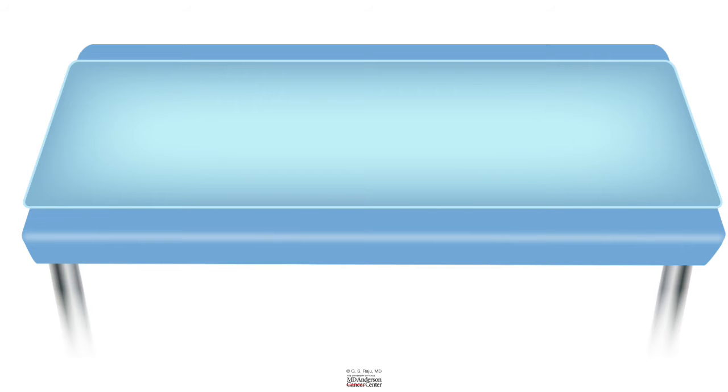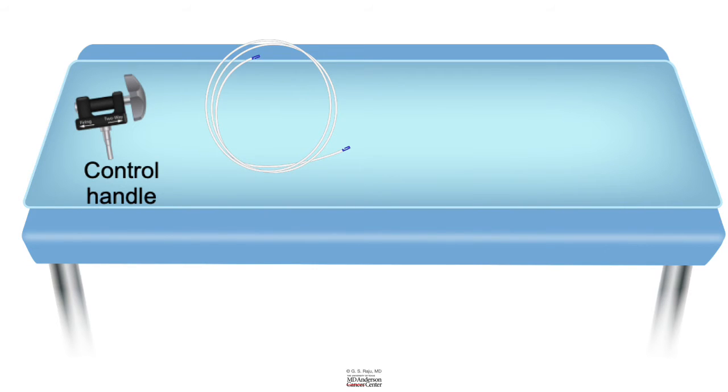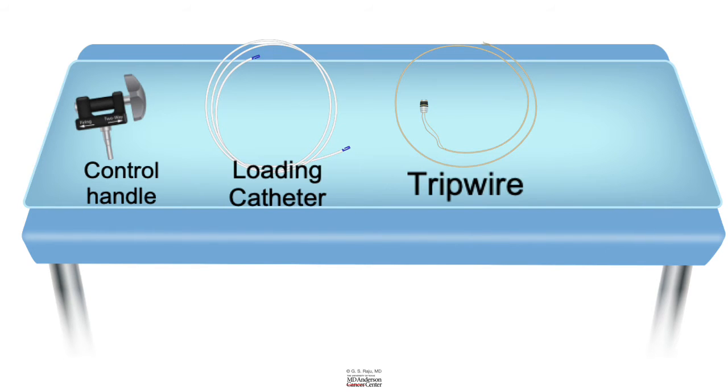When it comes to setup, when you open the package of a band ligator, you will see a band ligator control handle, a loading catheter, and a band ligator cap loaded with bands and attached to a tripwire, and you will also see an irrigation adapter.